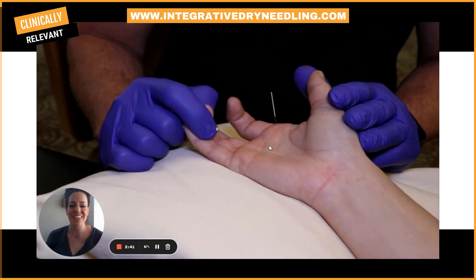As you can see here in the picture, the needle is through the A1 pulley into the tendon. We know that we can help reduce the local inflammation of the nodule itself, as well as the surrounding tendon, the surrounding sheath, and the A1 pulley. And this is really what we're all about at Integrative Dry Needling. Hopefully I gave you a little different perspective of how to treat trigger finger with the addition of dry needling. Thank you.